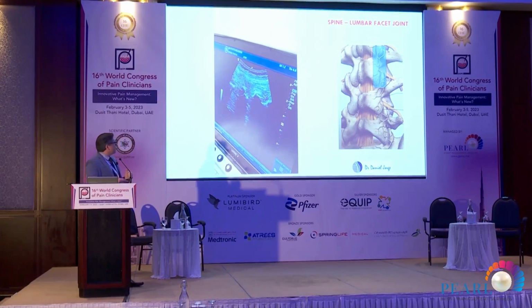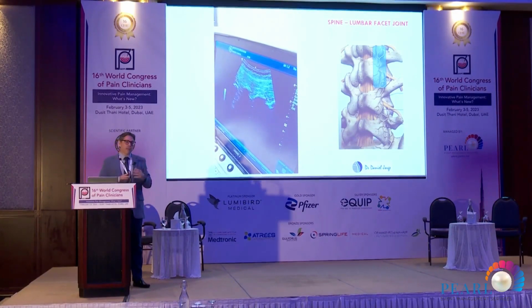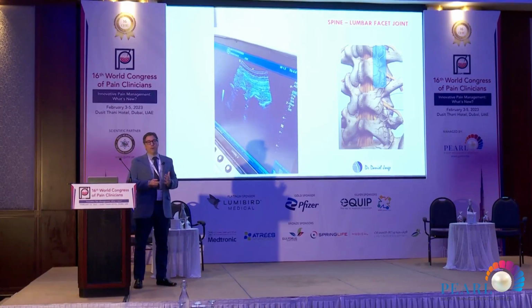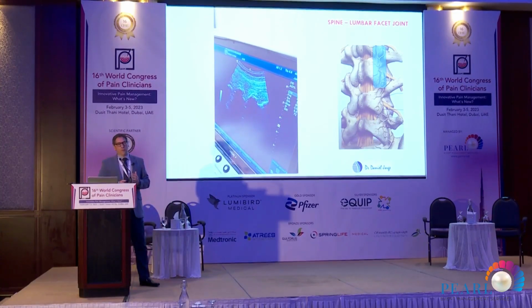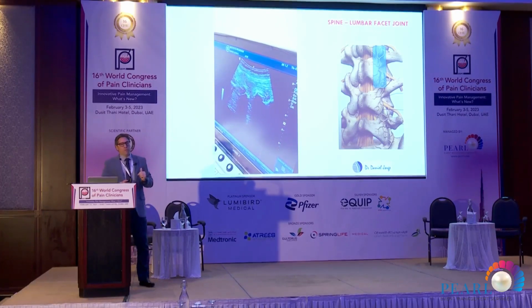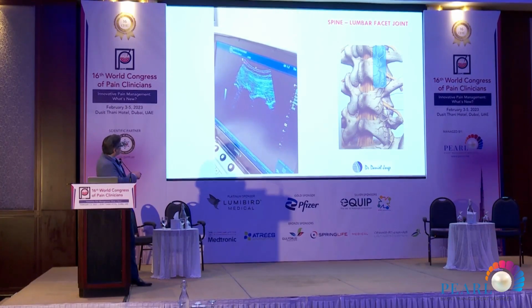And as you can see, when you are there, you can treat several levels, and that's what we are thinking and doing with our patients, noticing better results with the pulse radiofrequency for the spine. We thought that when we treat the level under and above, we may notice some better results with that. And you can reach as well, as you see here, with your cannula.